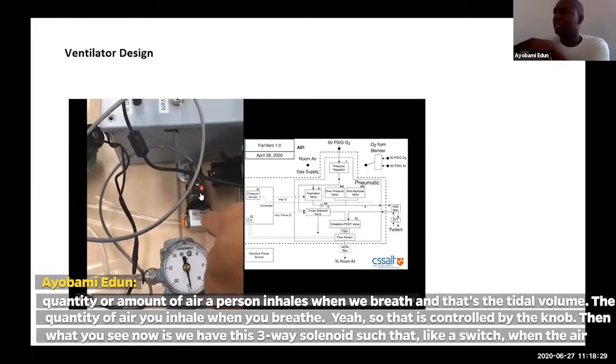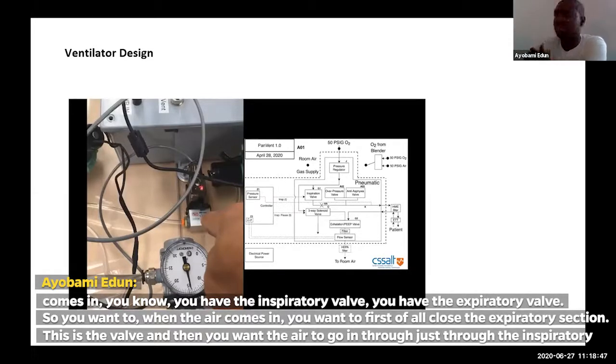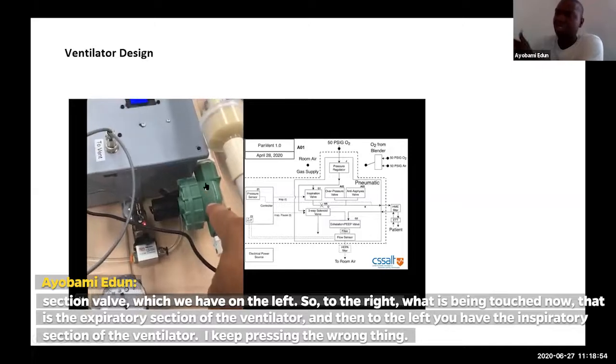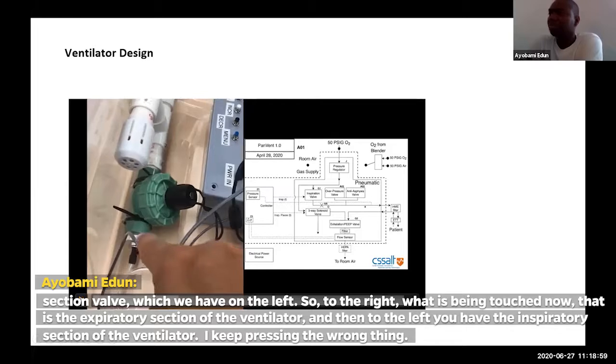And then what you see there now is this three-way solenoid, like a switch. When the air comes in, you have the inspiratory valve and the expiratory valve. When the air comes in, you want to first close the expiratory section, this valve, and then you want the air to go in just through the inspiratory valve, which we have on the left. To the right, what is being touched now, that's the expiratory section of the ventilator. And to the left, you have the inspiratory section of the ventilator.